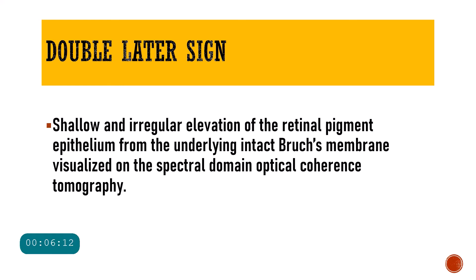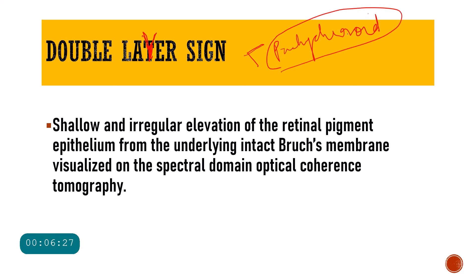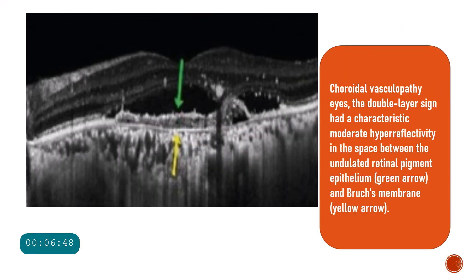Sometimes a double layer sign is also associated with polypoidal choroidal vasculopathy; however, this is not very specific and can be seen in other disorders within the pachychoroid spectrum. The double layer sign occurs when the RPE and Bruch's membrane get separated by hyper-reflective material, and this is seen on spectral-domain OCT as two hyper-reflective layers. In this picture you can see the double layer sign — one layer is the RPE and the other is Bruch's membrane, with moderate hyper-reflectivity in the space between them.